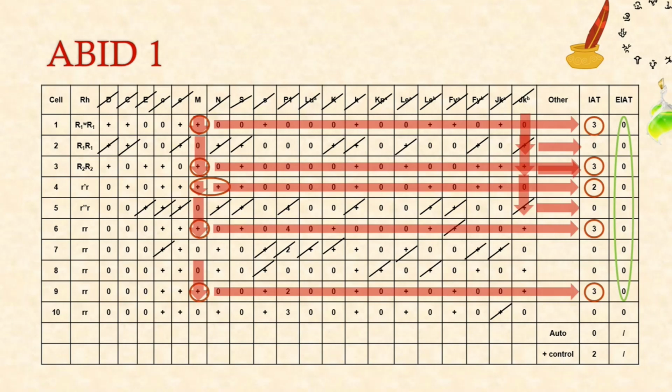At this point, though, how I do this, someone might say, oh, well, what I'm going to do is I'm going to confirm the presence now, whereas I'd like to just finish my exclusions. I like to finish my exclusions and then I'll go back to confirming if that's the case. So again, just to avoid repetitive strain, I've showed that we do have the exclusions there. You can see with the RH antibodies as well, what you're able to do with those, you can exclude an RH antibody using an enzyme panel. Just if I'm not aware of that, that is accepted within the BSH guidelines.